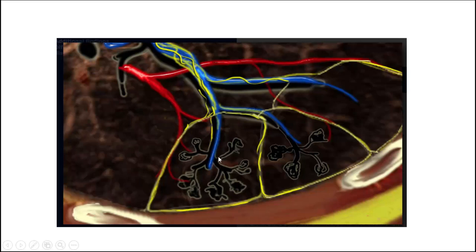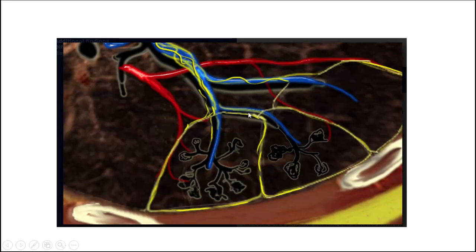In the middle of this secondary lobule runs the terminal airways, and each airway is accompanied by a pulmonary artery — this is the bronchovascular bundle. It is always accompanied by lymphatics. The surrounding of the secondary lobule contains the lymphatics and the pulmonary vein, so that is the basic unit of the lung.